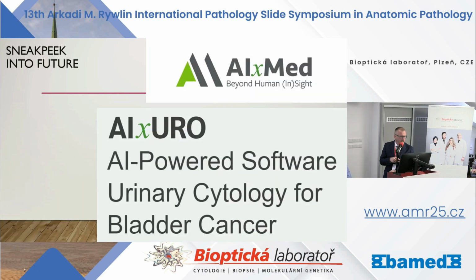And a little bit of sneak peek, because we are not finishing with, let's say, prostates. We are preparing the same for breast cancer, and right now we are starting even urologic cytology. And who is doing cytology from urine, mostly 10 or more cases daily, you know that cytology can be really tiresome. Mostly when you are looking specifically for one thing, cancer, you are looking again for everything.